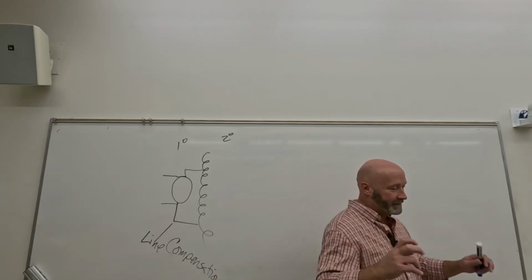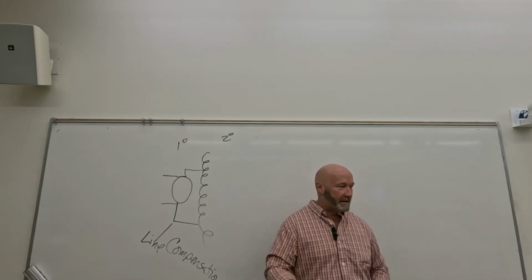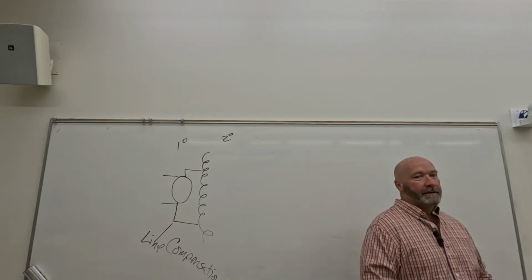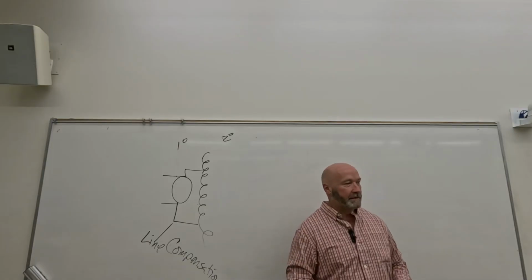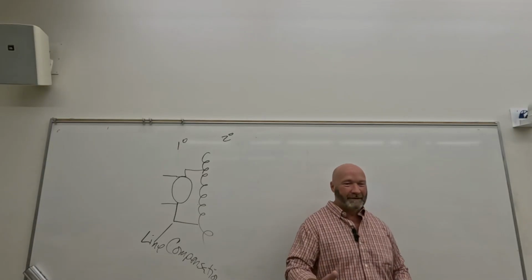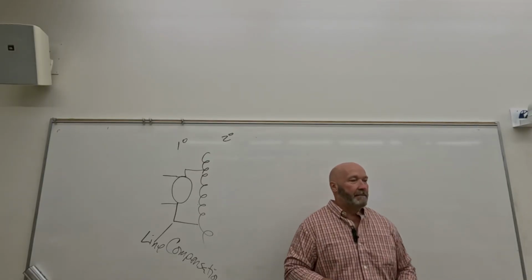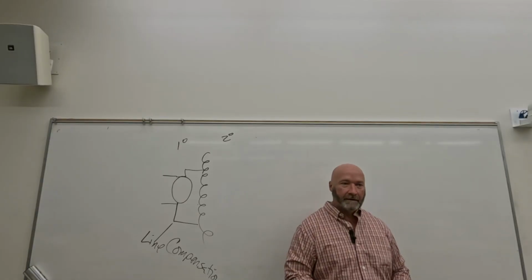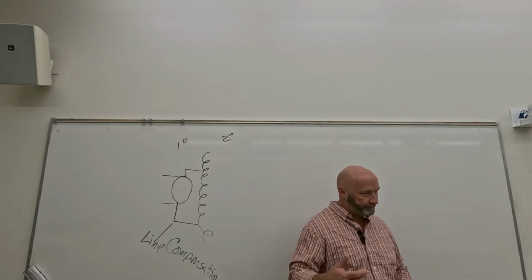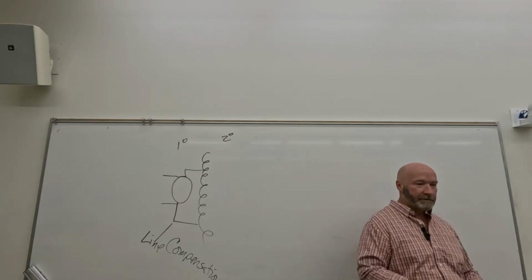So the couch, the x-ray table, has to have certain aspects to it. Directly under the tabletop is where you put your image receptor, right? Unless you're in our lab, you're not going to be taking the image receptor out and putting it in, but that's where it goes. That's what we refer to as the Bucky. Potter-Bucky diaphragm is the official name for it.